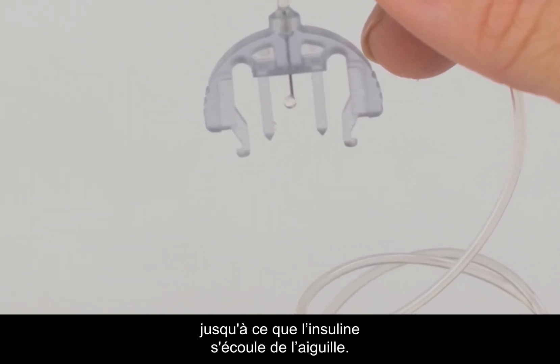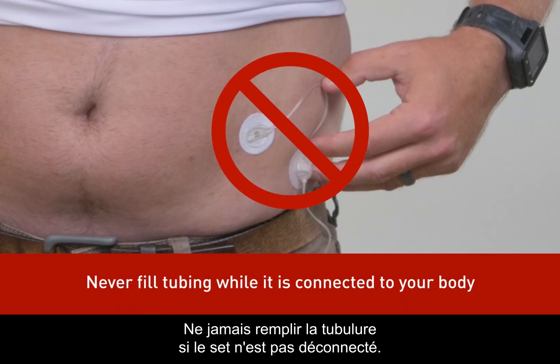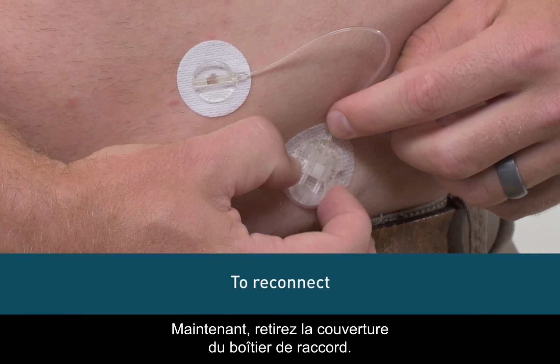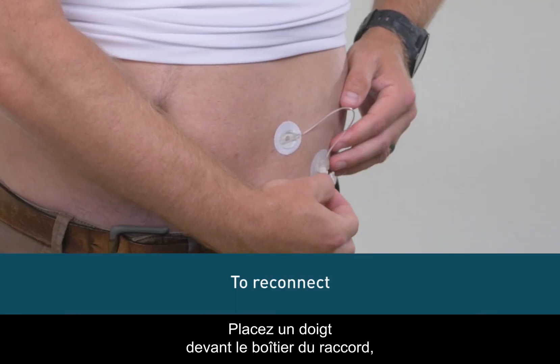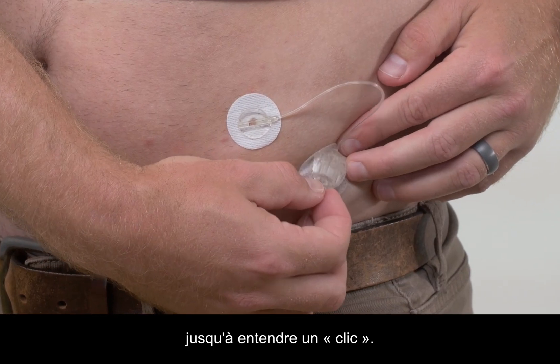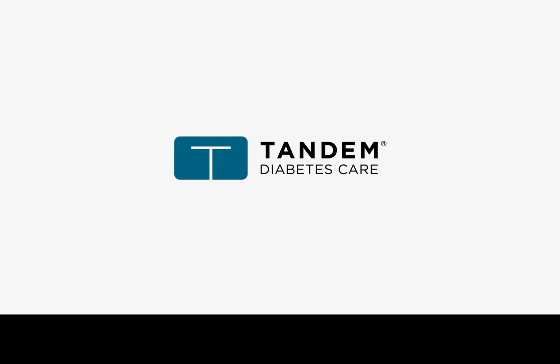To reconnect your set, remove the circular protective cap with the needle pointing down and fill the infusion set until you see insulin drip from the connector needle. Remember to never fill your tubing unless your set is disconnected. Now remove the cover from the coupling housing, place your finger in front of the coupling housing, and push the connector needle straight in until you hear it click.